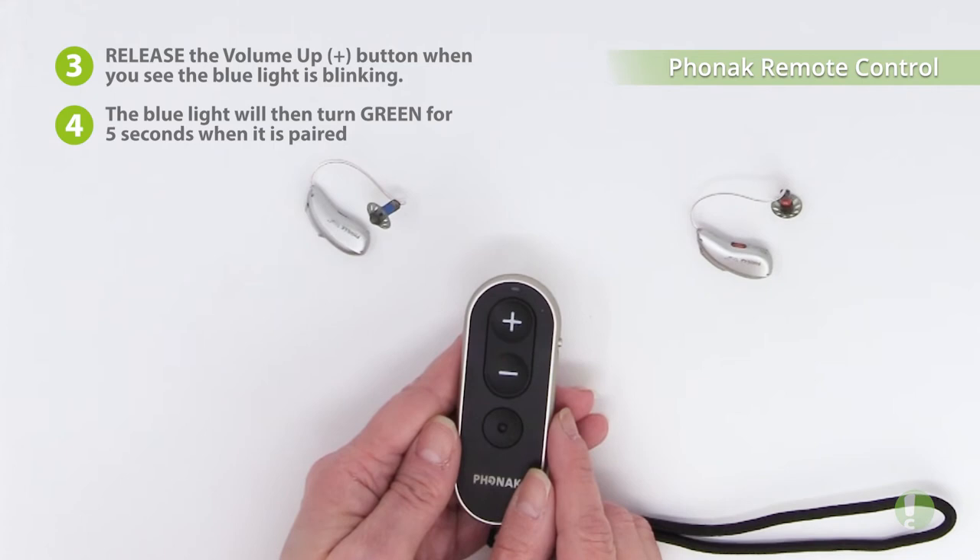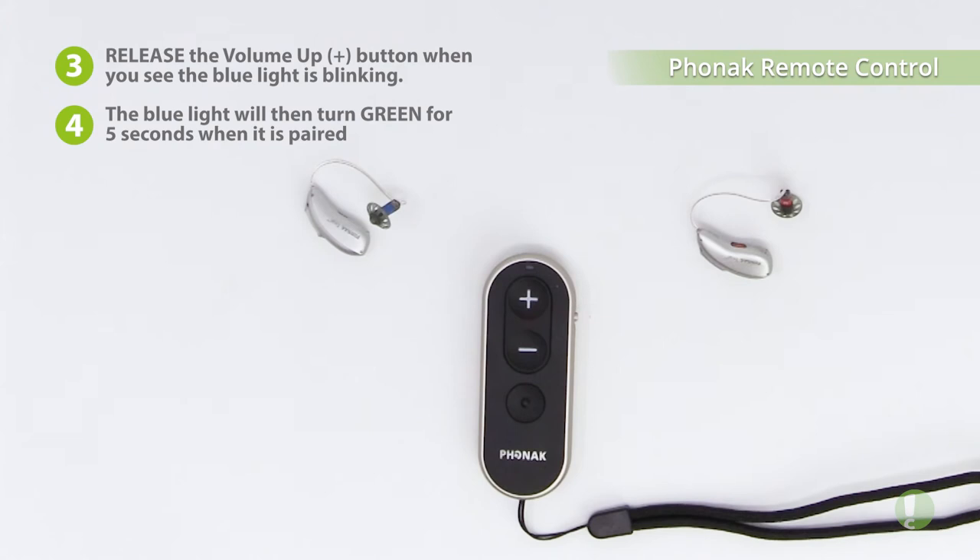After you see the green light and it stays solid for five seconds, you have successfully paired your Marvel hearing aids to the remote control.